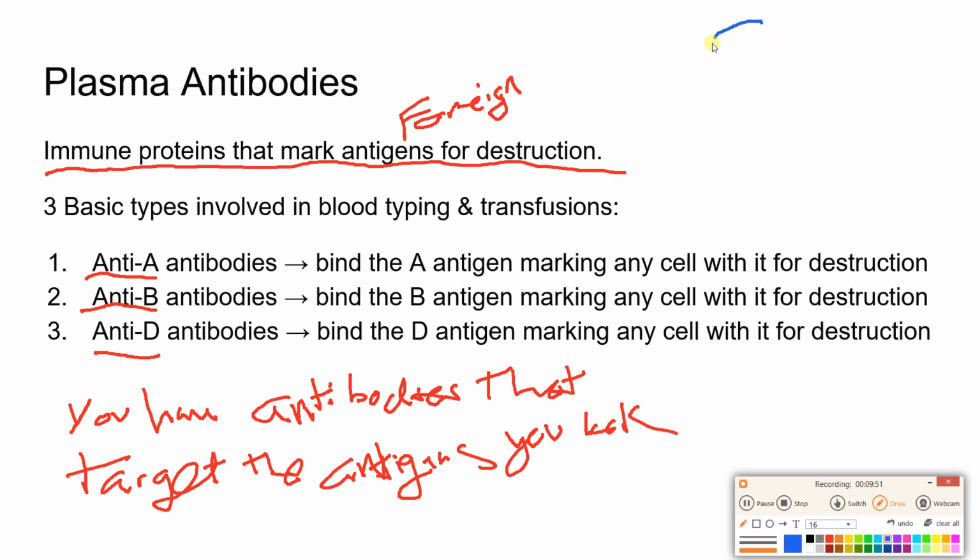What's my blood type? My blood type is O positive. Does my blood's plasma have anti-D antibodies? Do you expect me to have anti-D antibodies in my plasma? Cross my fingers here for your answer. No. I'm not going to have any anti-Ds. Because think about it. What does that plus sign mean? That plus sign means that I've got the D antigen. So I cannot have the antibody that would attack it, right?